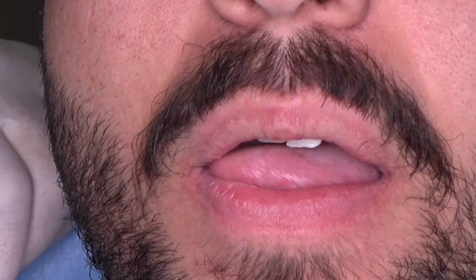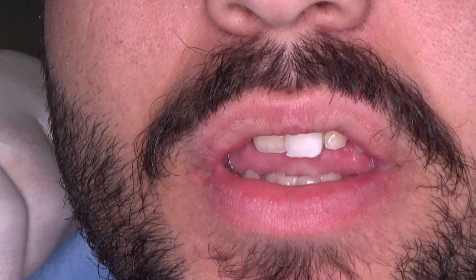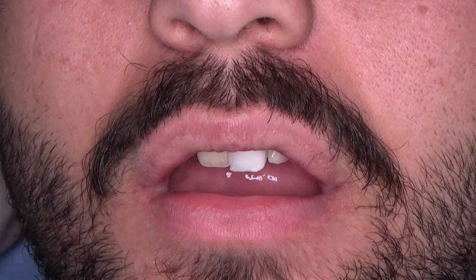Okay. So we define the new position of the tooth and we are ready to scan the jaw to make an STL file. This is the first option. The second option, if we don't have an intraoral scanner, we can take an impression of the mouth with the mock-up on the central incisor, send it to our lab along with the link that I showed you before, and they will upload the STL for us.